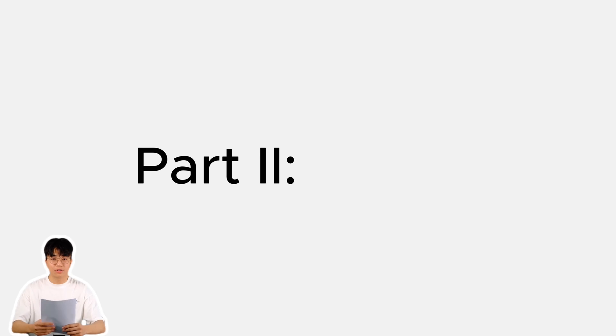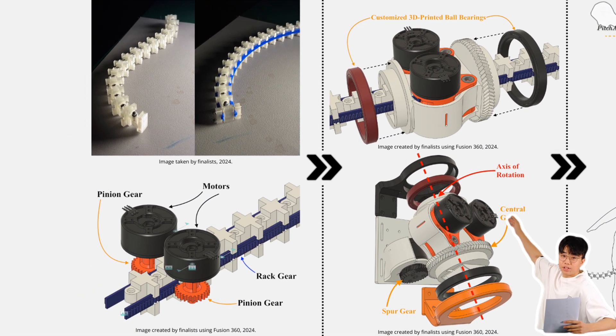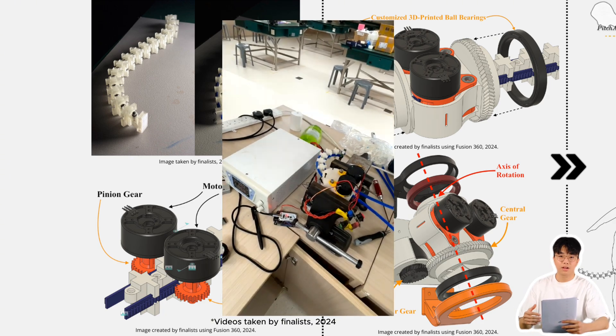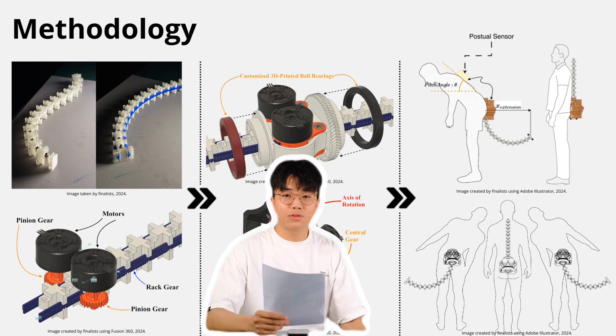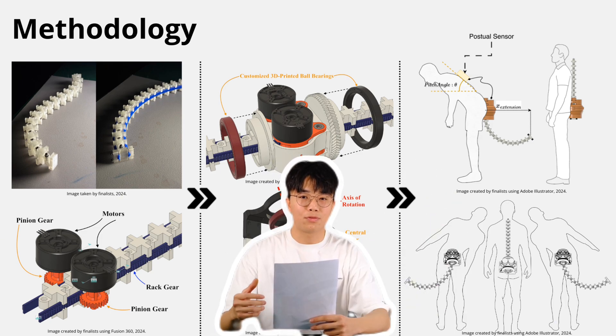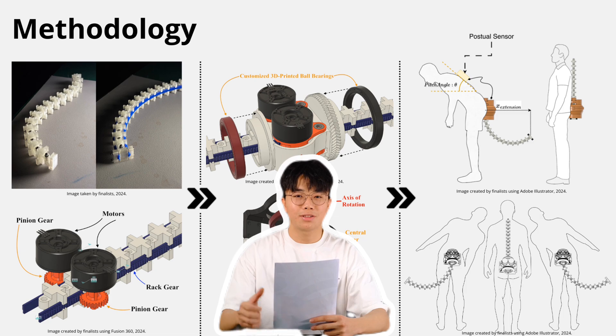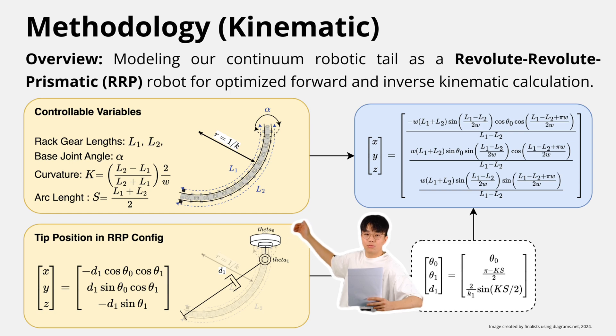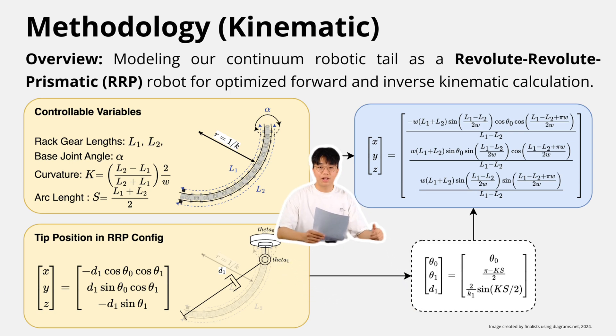Now let's talk about our tail's design. Our tail is engineered with 3 degrees of freedom, which allows it to move forward, backwards, sideways, and even rotate. Our innovative retractable mechanism keeps the tail compact when not in use, because walking around with a full-length tail 24/7 might raise some eyebrows. We mapped our flexible tail kinematics into a classical RRP robotic arm system, which simplifies the calculation of the exact angle and extensions.